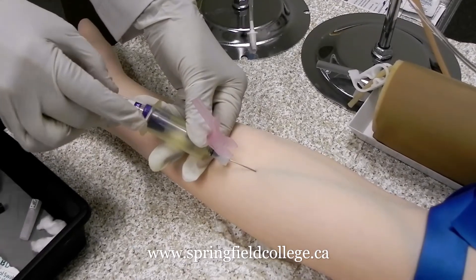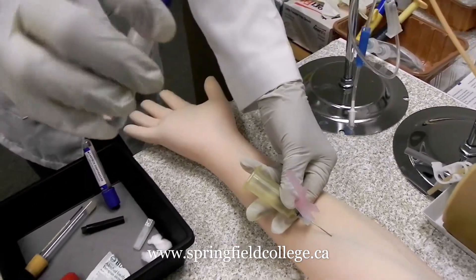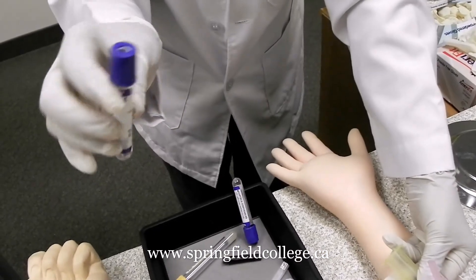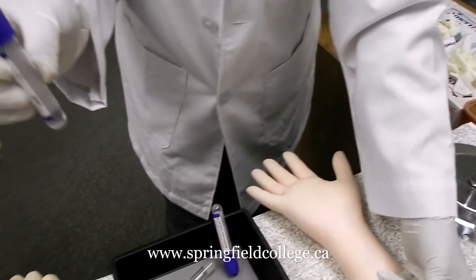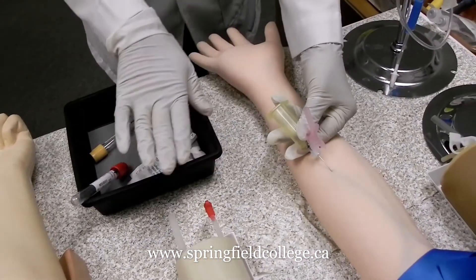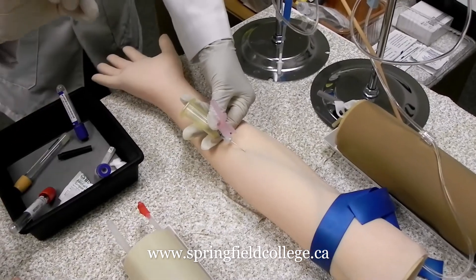Once collection is complete, if you are going for one tube only, this is the time to release the tourniquet. Wait patiently for some more time by the time it gets collected, then remove the tube and do your inversions — the number of inversions depending upon the type of tube. For a single tube you have the liberty of waiting 30 to 40 seconds, then completing this part and going for the inversion.